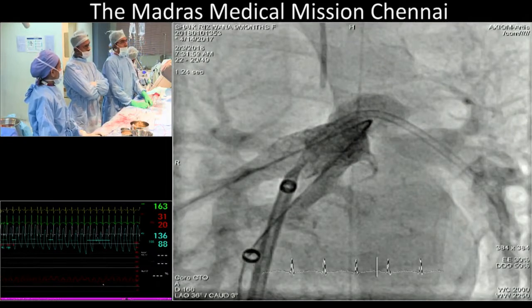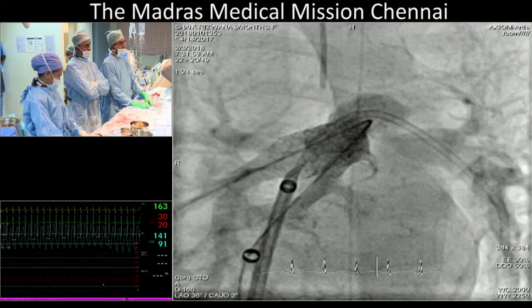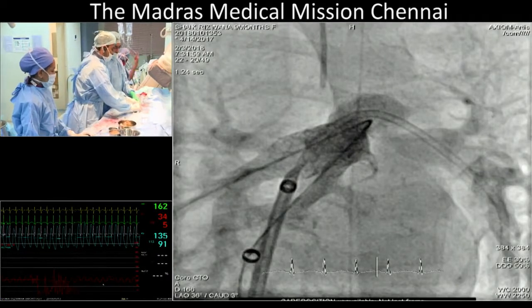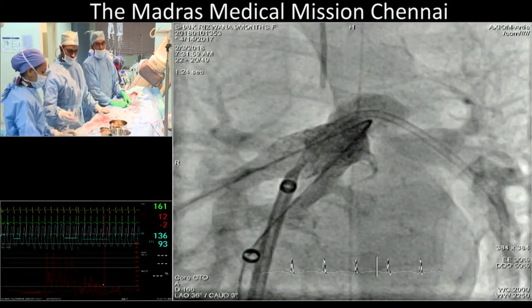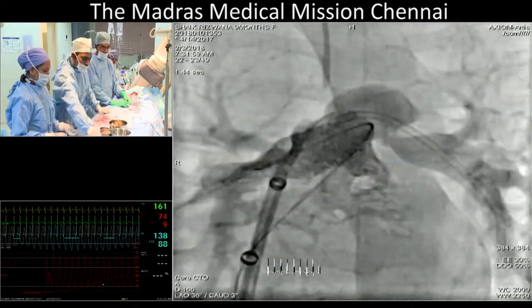Yeah. So now the decision in my mind is easier because you've stented the right. Now I would stent the left. I think so. I will connect back to the right ventricular pressure. It's interesting how starting from the general consensus on not stenting at all anything here, we are ending up stenting everything.